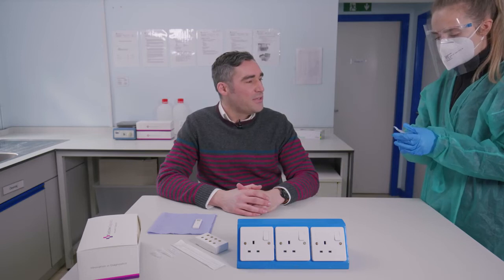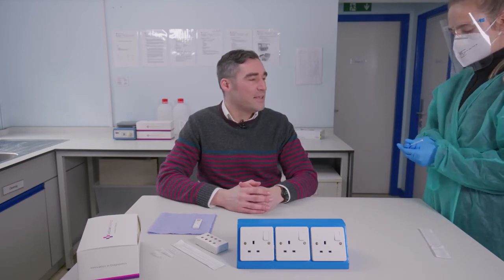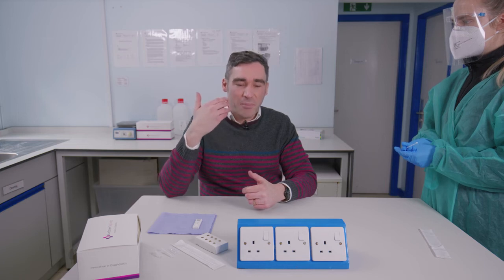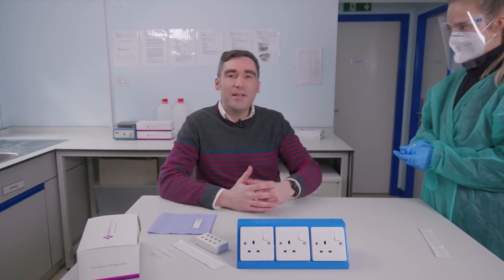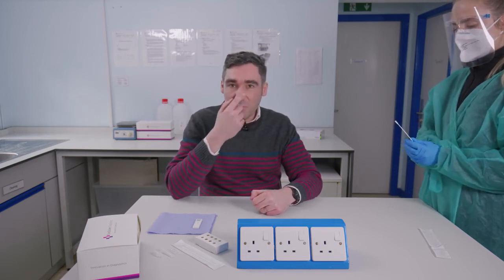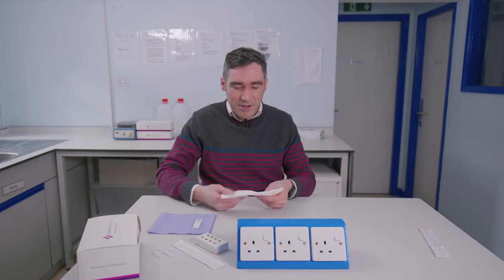Alice is going to use the anterior nares swab to swab both of my nostrils. The first thing to do is blow my nose so that moves any sample from the back of the nose to the front of the nose to make sure we get a good sample on the swab. The swab needs to go in probably a couple of centimetres and then it's rotated against the front wall of the nose, just below the bridge of the nose.